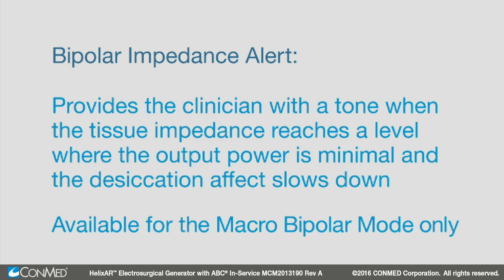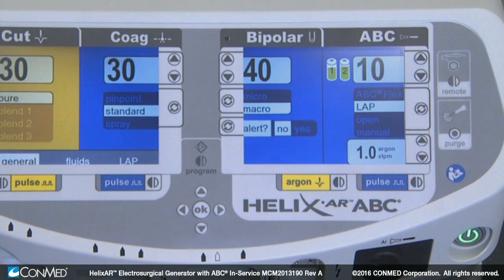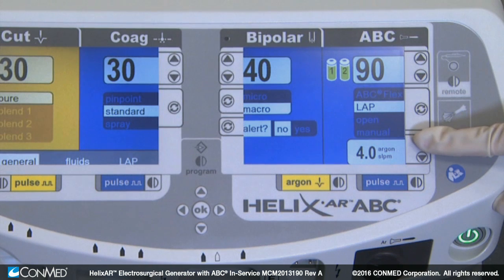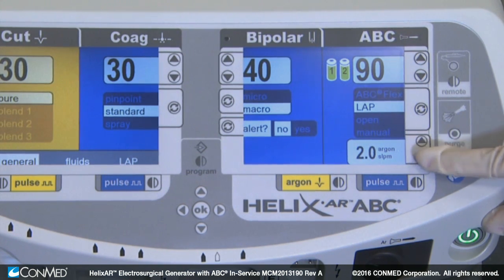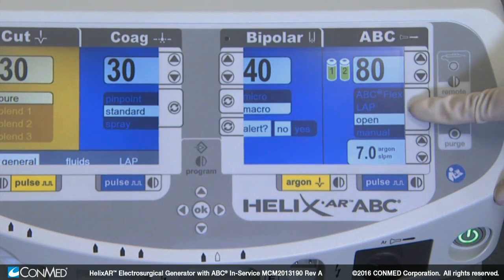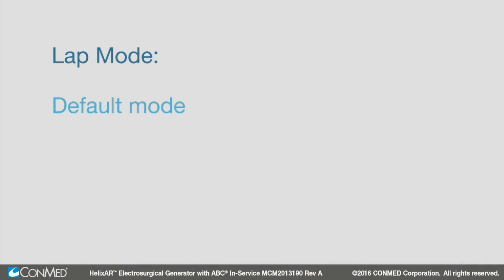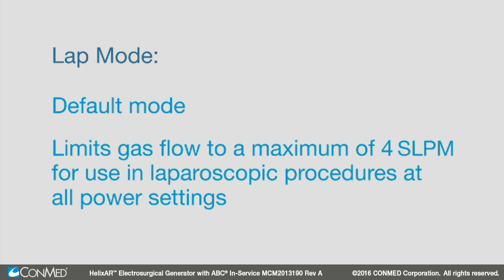Moving to the argon side, low tank indicators will be displayed when the tank pressure is less than 250 psi. Ensure a second tank is connected with a pressure near full when placing the system in use. The ABC power adjustment key adjusts the output power settings. The default power setting for ABC is 10 watts. The argon flow adjustment keys adjust the flow of argon in SLPM, or standard liters per minute, for laparoscopic, open, manual, and ABC flex modes, which can be cycled through using the ABC mode selection key. Lap mode is the default mode and limits gas flow to a maximum of 4 SLPM for use in laparoscopic procedures at all power settings.